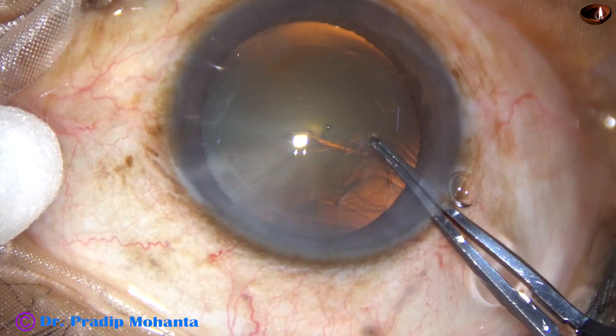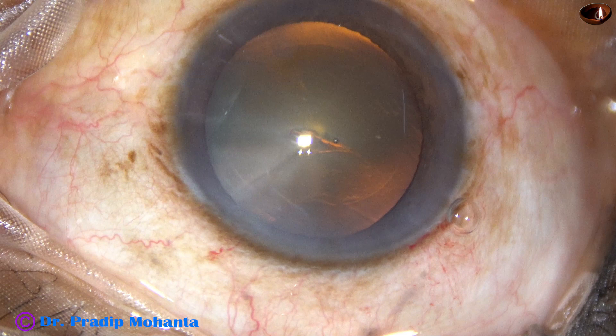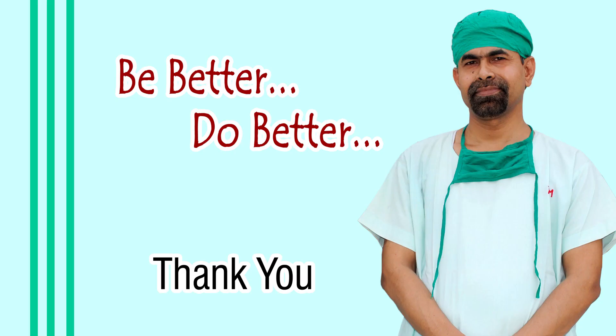So with utrata forceps, just by the utrata itself, we can do the rhexis, or we can take help of a needle to raise the initial capsular tag and complete the rhexis. Thank you very much for your attention.